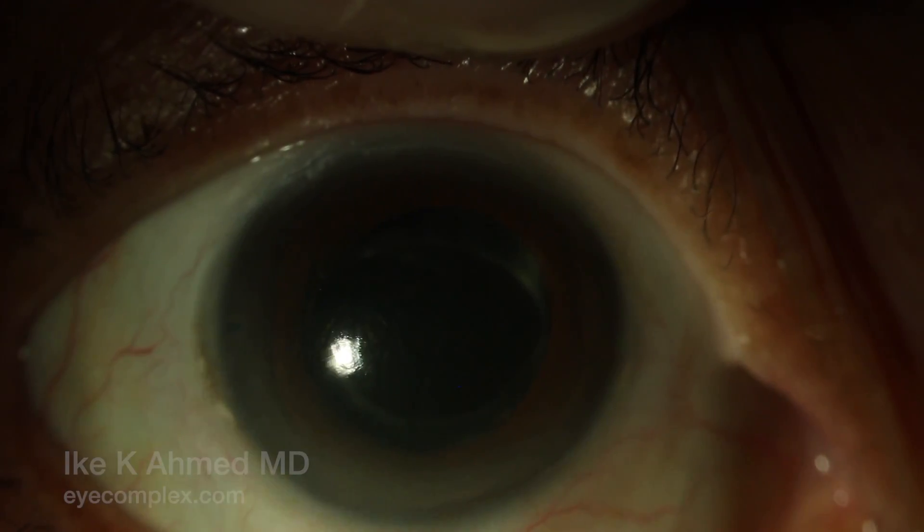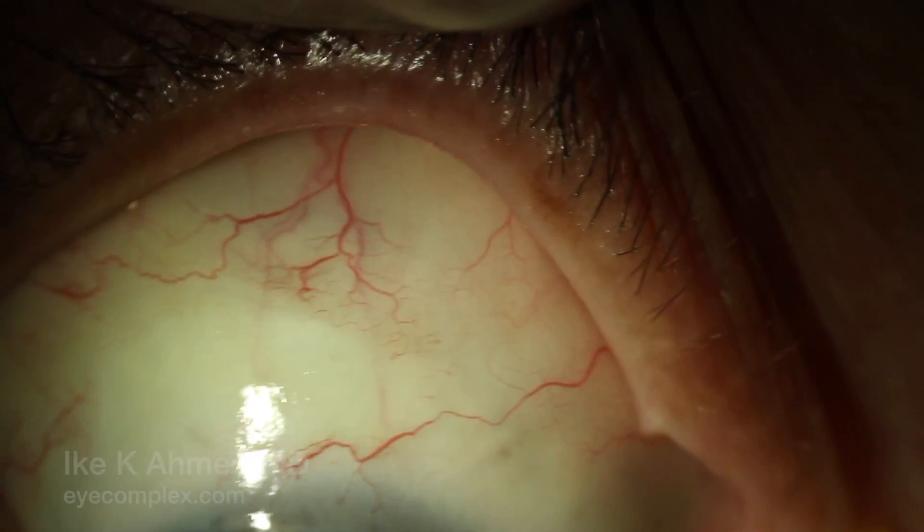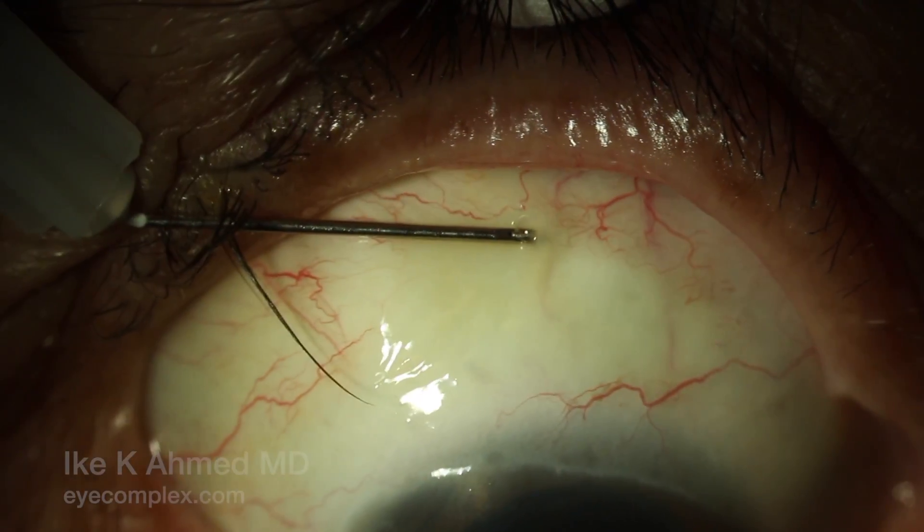This video describes post-operative needling for a fibrosed Xen with a fairly flat bleb. Mitomycin 0.5 mg per cc has already been injected just posterior to the bleb prior to needling.